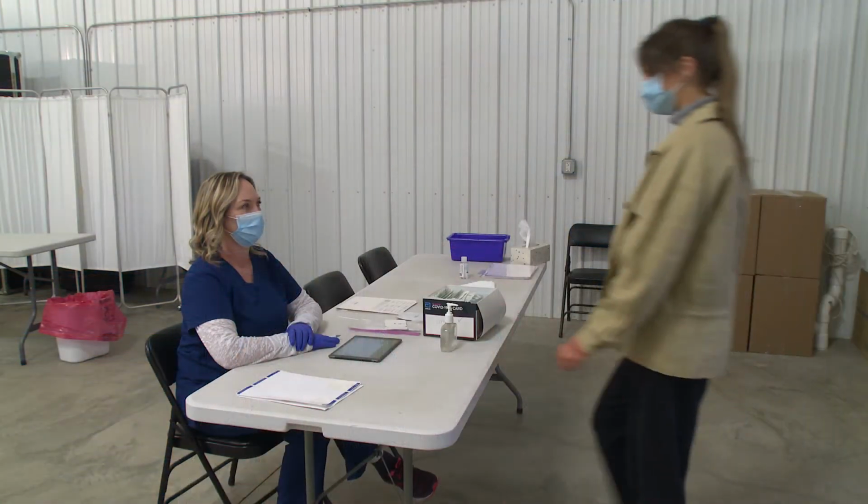If you are a facility that's been given a specific QR code and a specific website for individuals to register at, if somebody registers at the testreg.nd.gov website, you will not be able to visualize them within your system. There is a video that will have been provided to you by NDIT or your BinaxNOW liaison that explains the registration and the reporting process within Power Apps for BinaxNOW.